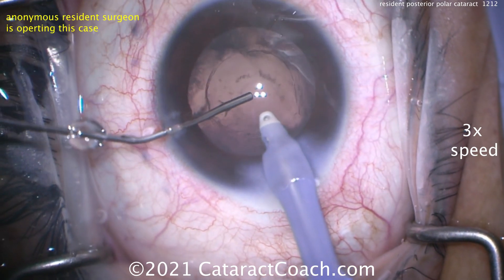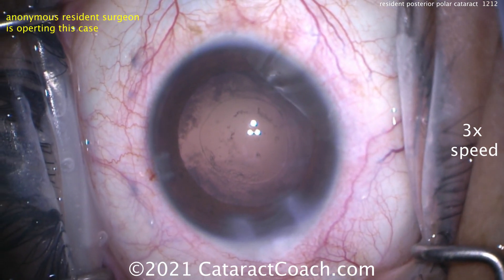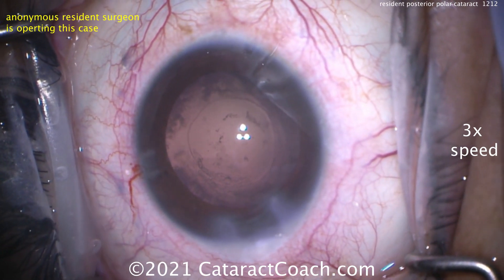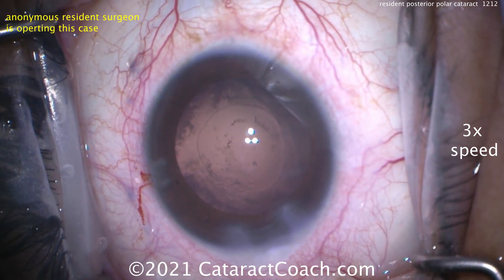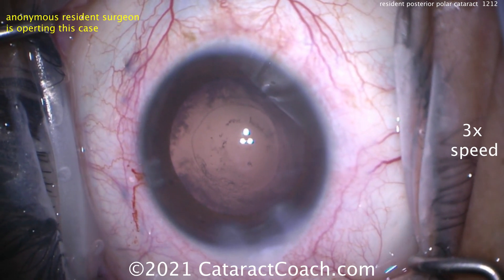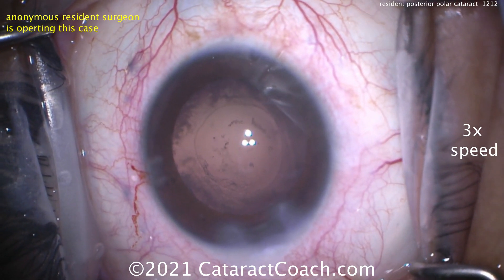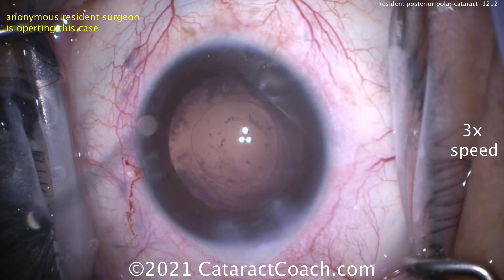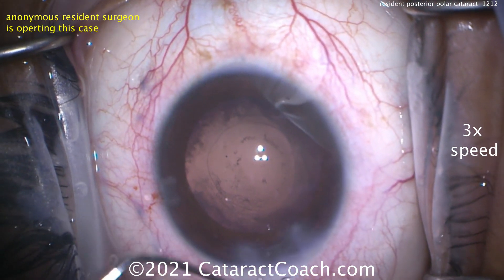If you see any smudgy stuff on the posterior capsule, please don't touch it — the capsule may look okay but it's super weak. I don't even let the AC collapse; I'm going to inject viscoelastic as the resident pulls the IA probe out of the eye. The trick is to start injecting, then go to position 0, keep injecting, and then pull the probe out. Don't keep the probe in position 1, because you'll just wash out that cohesive viscoelastic. There's a little remnant on the posterior capsule — we don't mind. Now get the lens in.